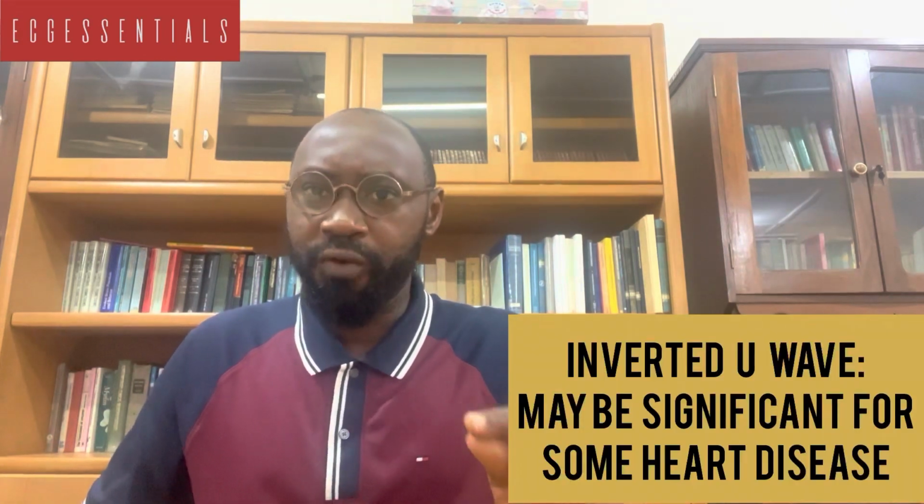Okay. We said that the other abnormality that we should be looking out for is whether the U waves are inverted. And a negative U wave, I must say, is usually notable for some heart disease. It may be coronary artery disease, long-standing hypertension, a congenital heart disease, a cardiomyopathy. But usually when we find negative or inverted U waves, it is significant for some underlying cardiac pathology.